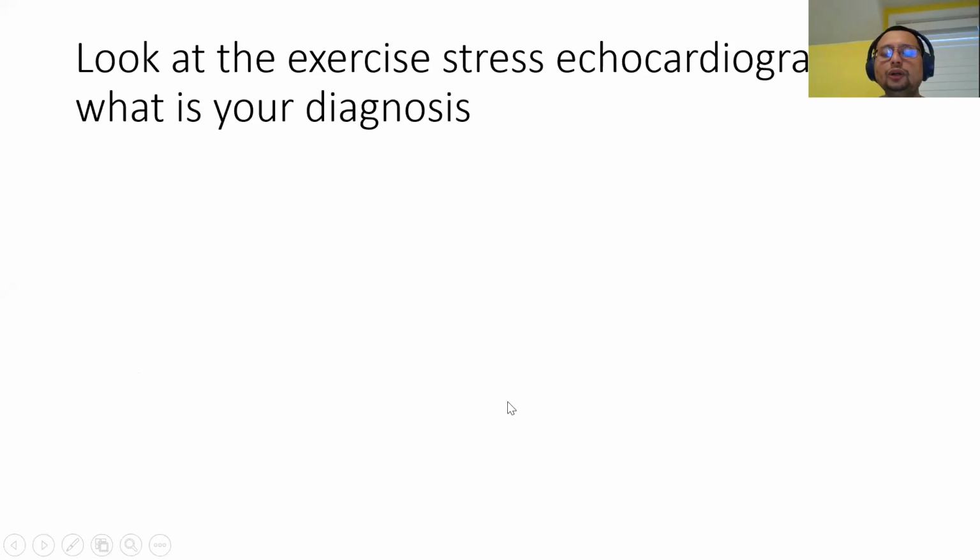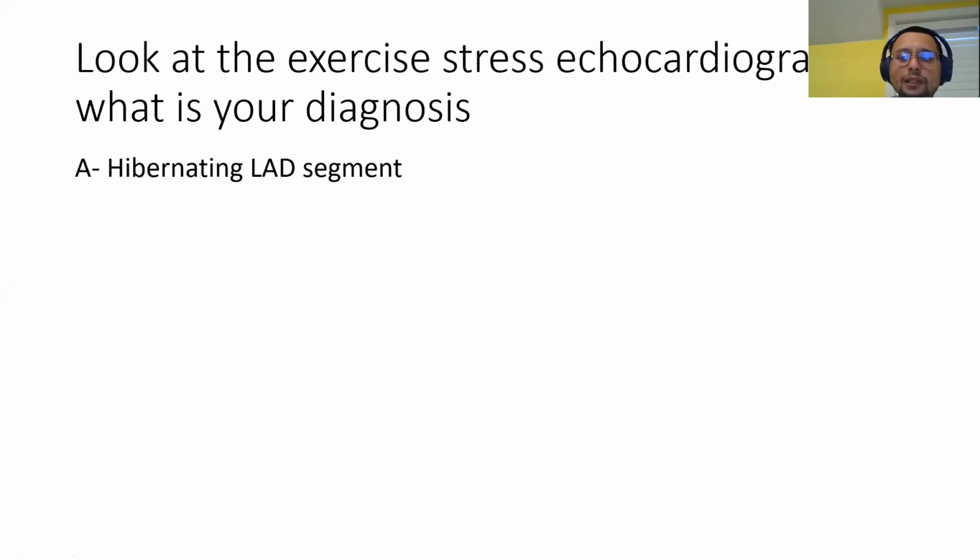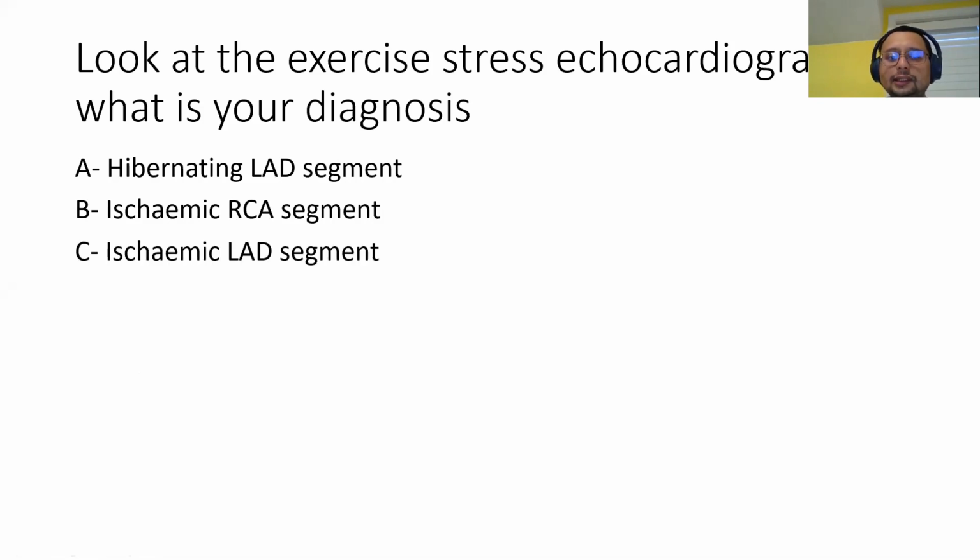Looking at the exercise stress echocardiogram, what is your diagnosis? Is this a hibernating LAD segment? Is this ischemia of the right coronary artery? Is this an ischemic LAD segment? Or is this multi-vessel ischemia? You can all answer in your own mind.